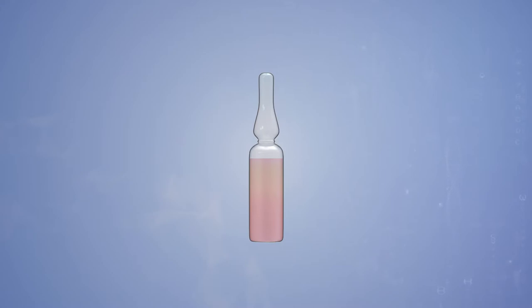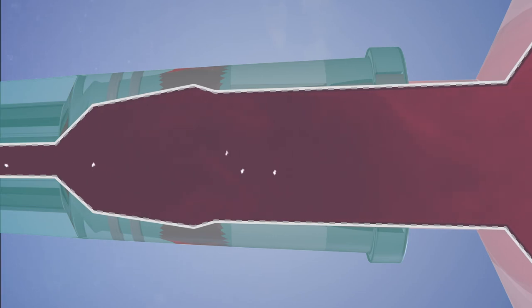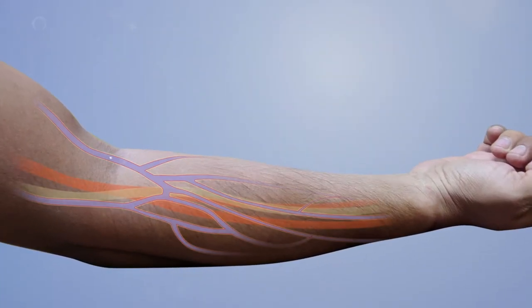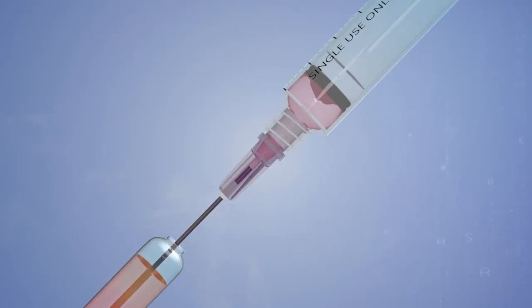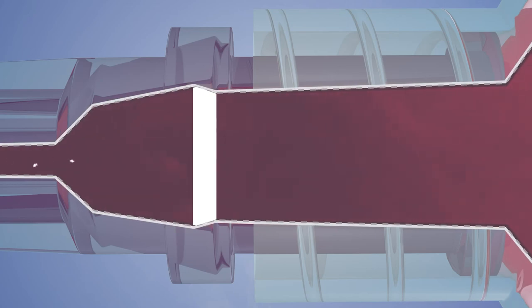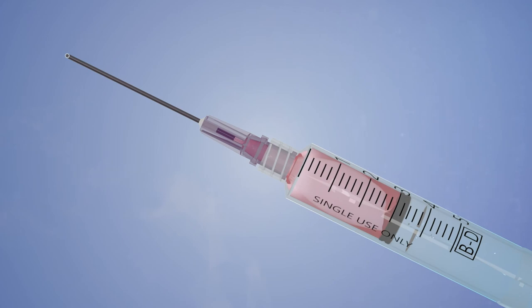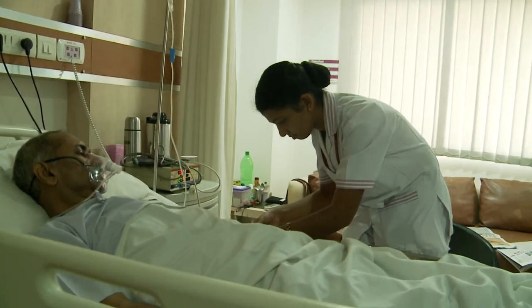When using an ampule, there may be chances of small glass pieces entering the conventional needle when the ampule is broken, which may contaminate the medication dosage and harm the patient. The blunt filter needle has a 5-micron filter which prevents these small pieces of glass from entering.